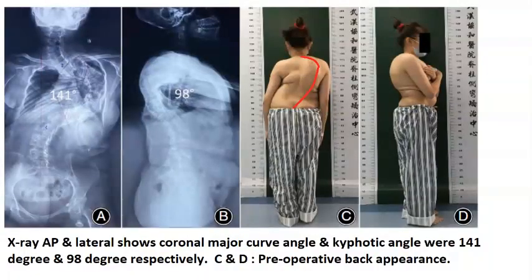This figure shows an X-ray of the AP and lateral view of the spine. It shows a coronal major curve angle and kyphotic angle of 141 degrees and 98 degrees on the lateral view. For C and D, it shows the preoperative back appearance.